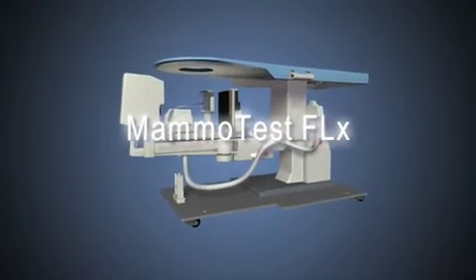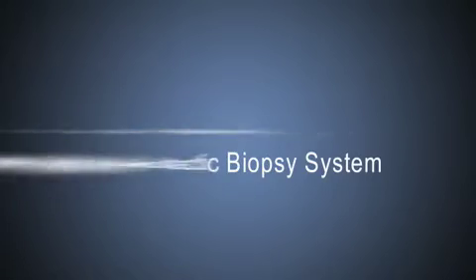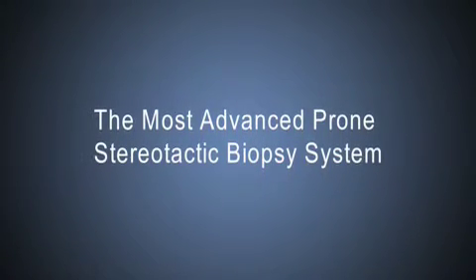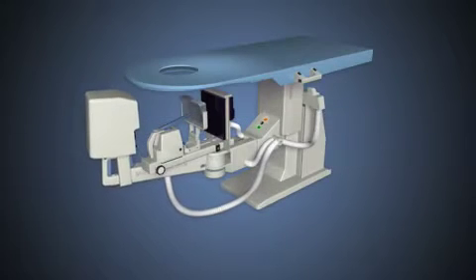Based on the cutting-edge design from Fisher Imaging, the MammoTest FLx is the most advanced prone stereotactic biopsy table available, exclusively from EcoServe.